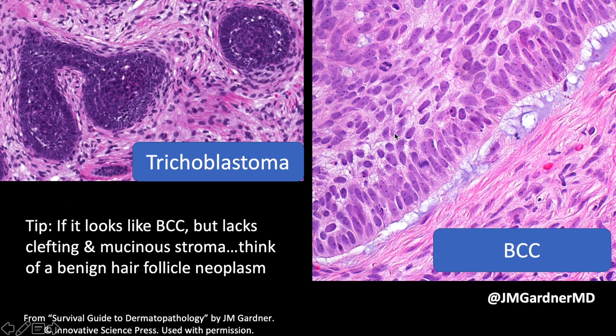This is another benign hair follicle tumor called a trichoblastoma. In my opinion, trichoepithelioma and trichoblastoma are both benign hair follicle tumors that probably exist on a spectrum. The name matters less than recognizing it's benign and not BCC. If it looks like BCC but you don't see good clefting and mucin, and the stroma looks cellular and is hugging the nests, think benign hair follicle neoplasm. These can be tricky — if you're not a dermatopathologist, consider getting a consult.